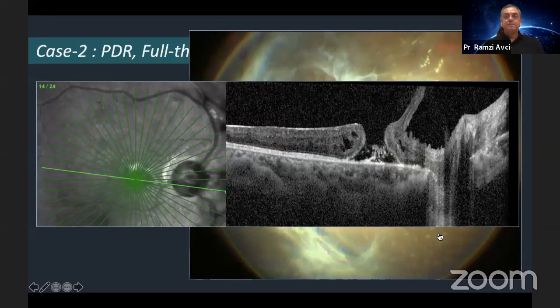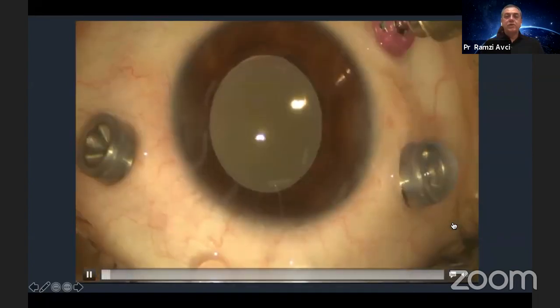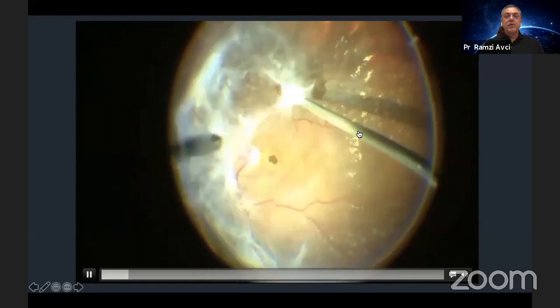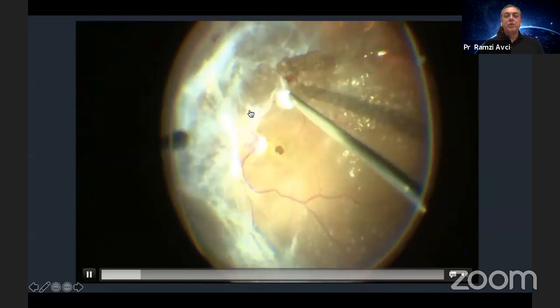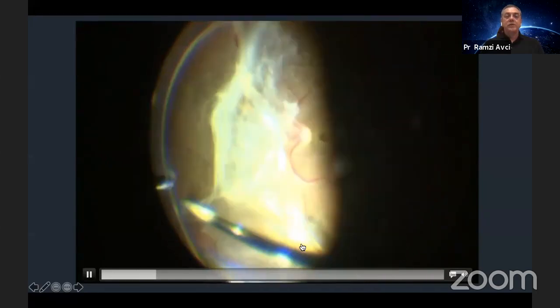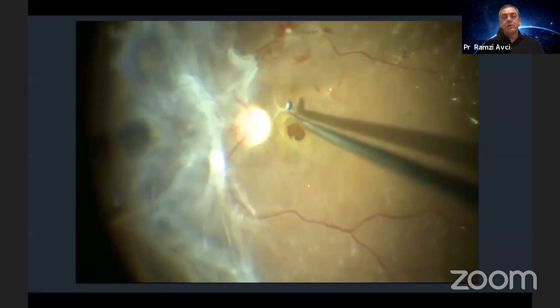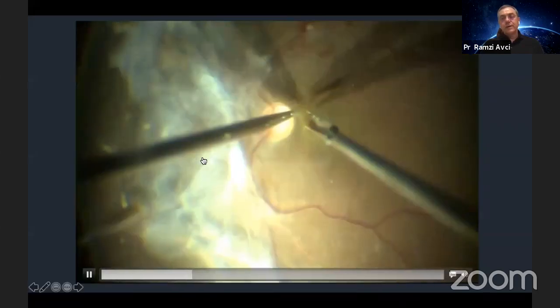So in this patient, we apply combined surgery. After cataract surgery, we focus on the vitrectomy. After the vitrectomy in such a patient, first I remove the connection of the membrane on the posterior pole to the anterior, cutting the edge of the hole and the partially detached vitreous, and then I focus on the macular area before the cornea gets edema and blurred vision. There is a very strong adhesion, and therefore I use scissors.